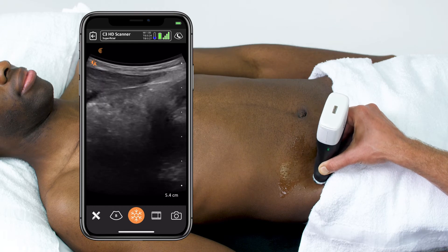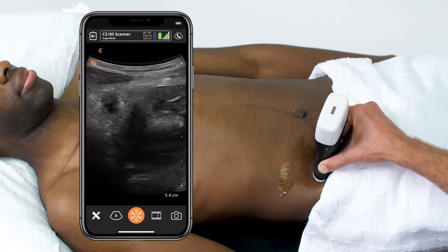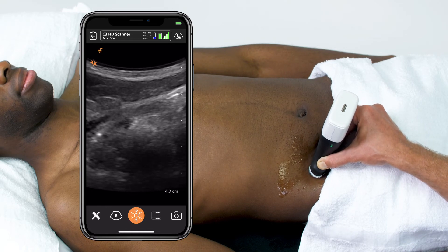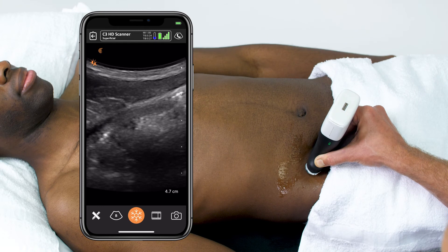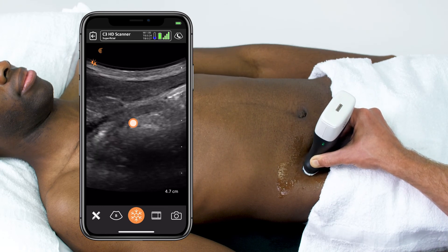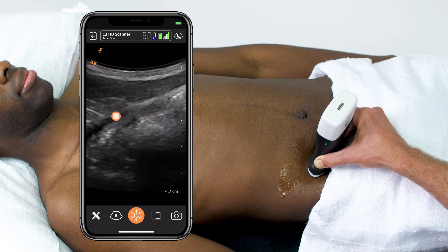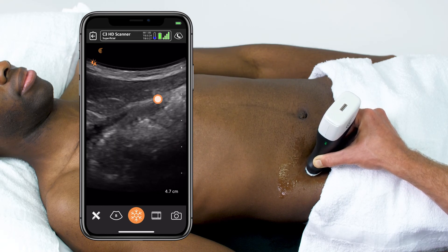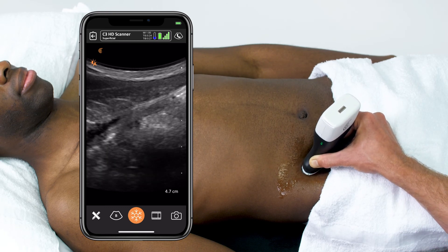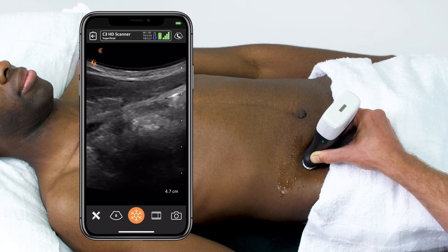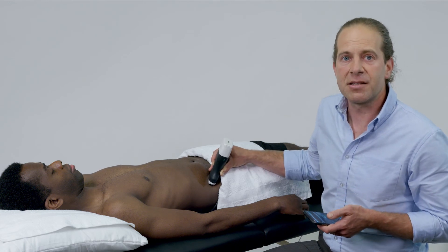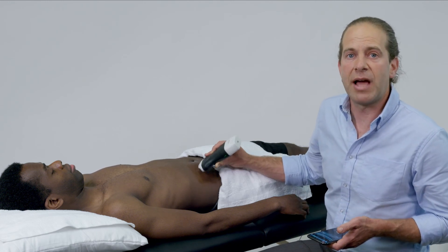Once I'm there, I can go back up into the abdomen, and with a bit of luck and exploration, I'm going to try and identify the structure most consistent with the appendix. It can be tricky to find attached to the cecum, but once you've identified a small blind-ended structure — here measuring only a couple millimeters in thickness — you can see why getting such a high-quality image is so important to really effectively identify a normal healthy appendix. But once I have identified the appendix, I can feel confident that I have essentially ruled out the disease.